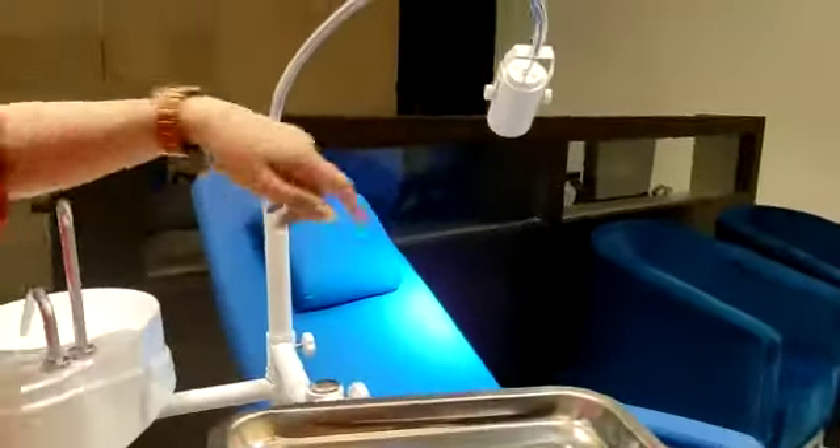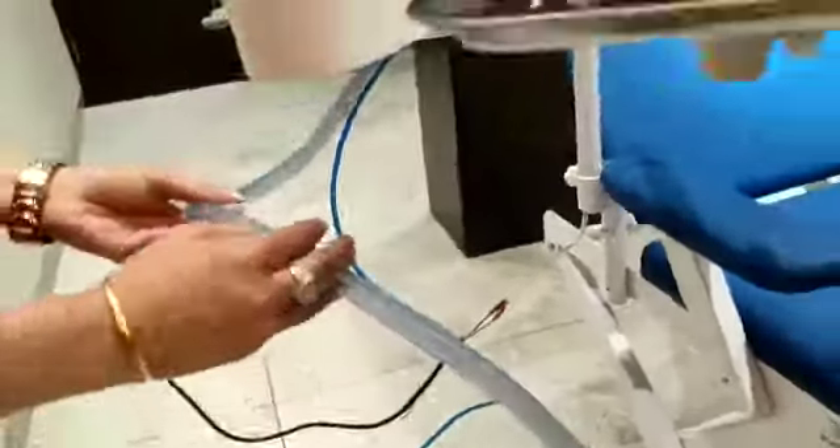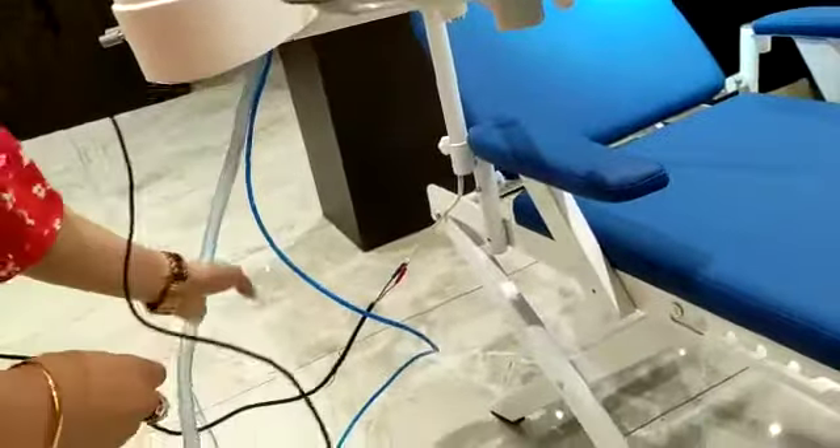This entire attachment is detachable — you can see it is detachable. It can be fixed on the right side as well as on the left side of the chair. Along with this, we have the drainage pipe for the water drainage.